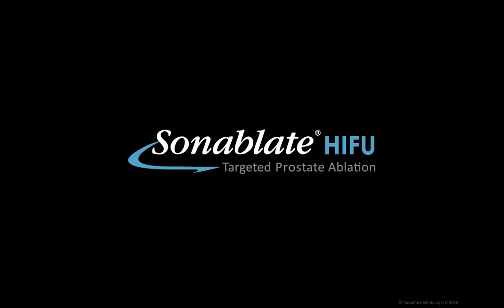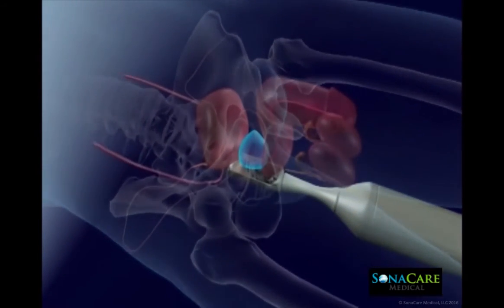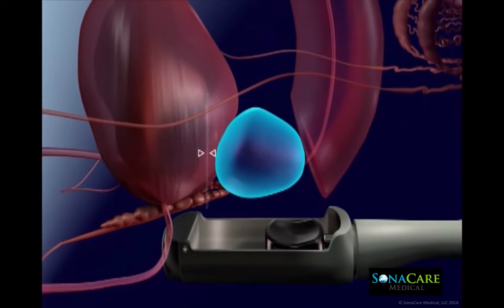The Sonoblate system is a physician-guided robotic device that is FDA cleared for transrectal high-intensity focused ultrasound ablation of prostatic tissue. High-intensity focused ultrasound, or HIFU, is delivered via a transrectal probe that is securely positioned in the appropriate anatomical orientation at the beginning of the procedure.